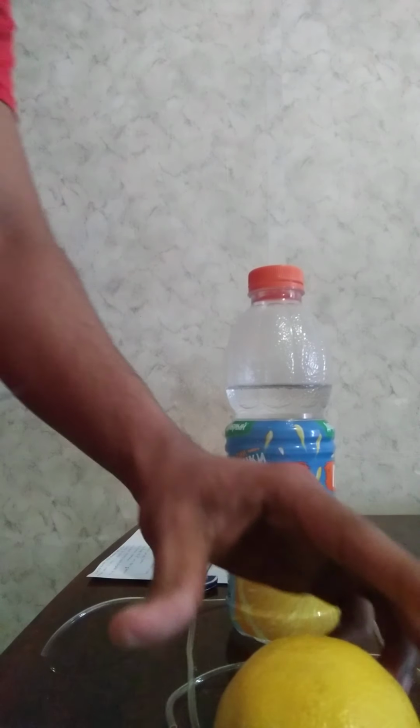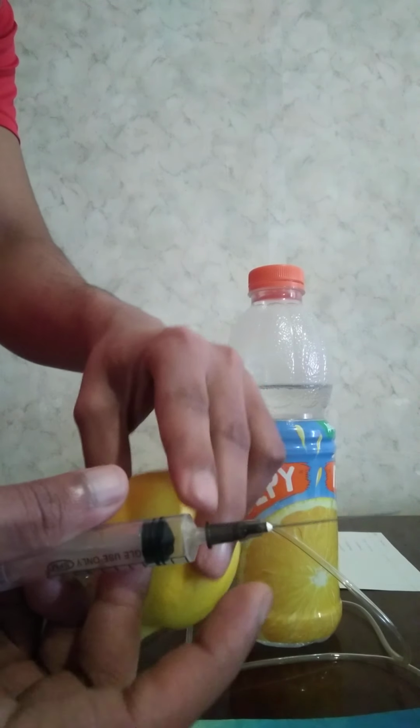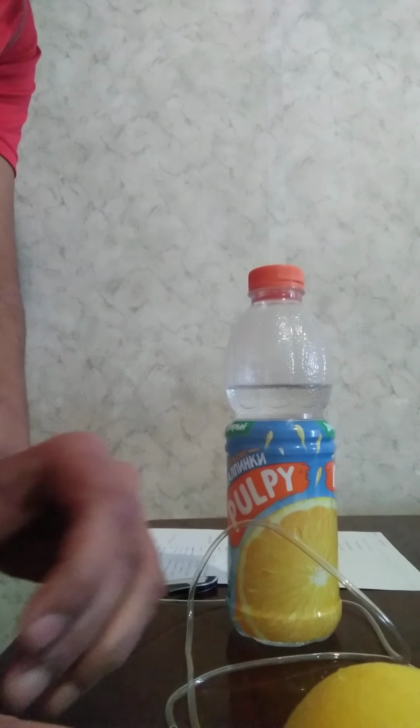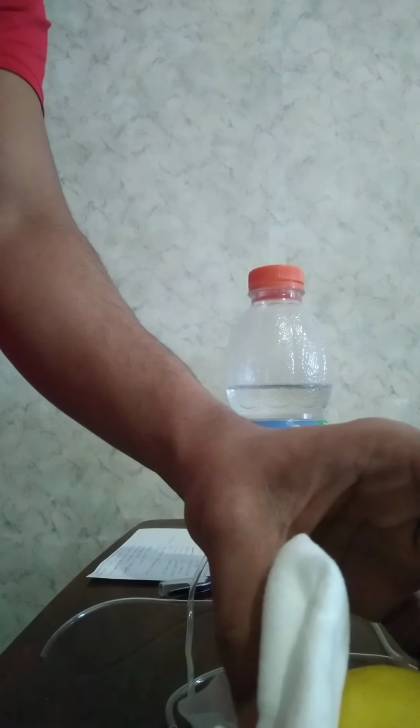So if this is the deltoid region, the triangle is made, and we will be infiltrating through the base. The needle is held such that the index finger is below the flash chamber like this, and the rest of the fingers will be supporting the needle. It's advanced at a 45-degree angle to the skin, like so. Once it's inside, this hand will fix the syringe. You can release this hand and advance the solution. Once the solution is inside, you can put cotton on top and then withdraw the needle.